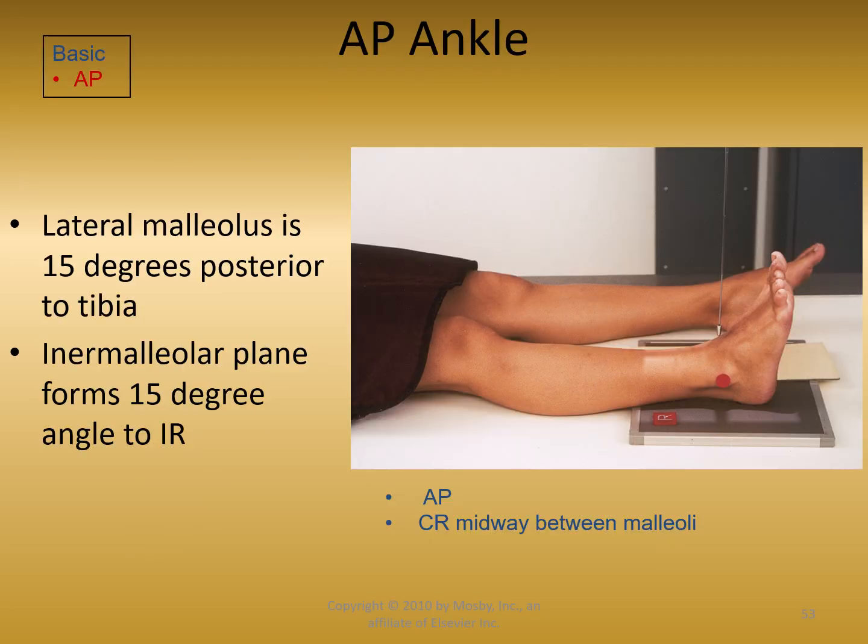Going back to that intermalleolar line, let's think of the IR as we're looking at the leg laying on the IR. Let's imagine the IR being the mid-coronal plane, because that's the way the mid-coronal plane lies along this patient's leg. It goes right down the middle of the leg like this. It's a plane that goes down the middle of their leg, such as this entire IR. If we took this entire IR and shoved it up into their leg here, that would be the mid-coronal plane of that leg.